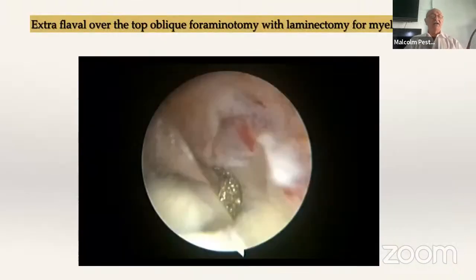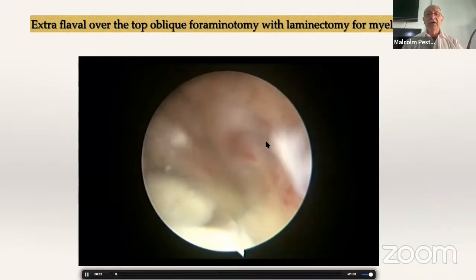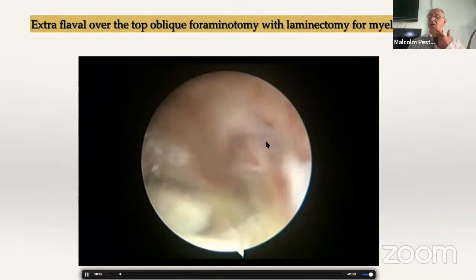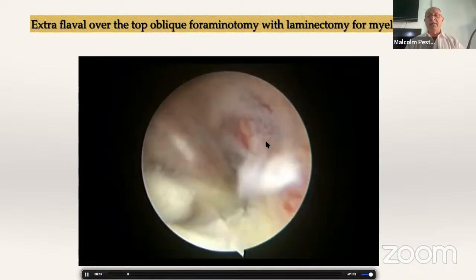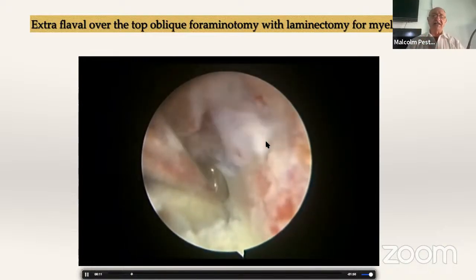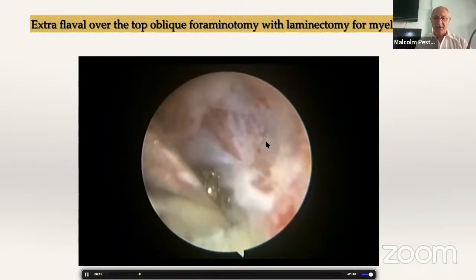Now, even in the cervical spine, people used to initially say you can't go over the top decompression. But last year when I was in France, I presented this video and I'm playing it again. And see me going over the top into the contralateral foramen. So you can do an over the top. There is a technique to it, but once you master it, it becomes very easy to do an over the top decompression, even in the cervical spine.